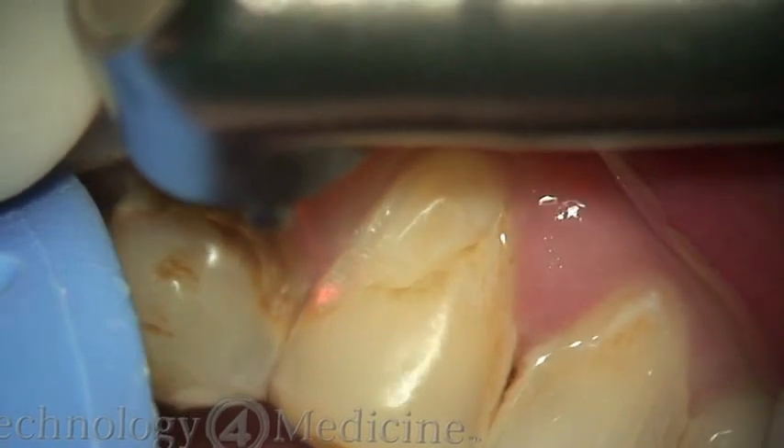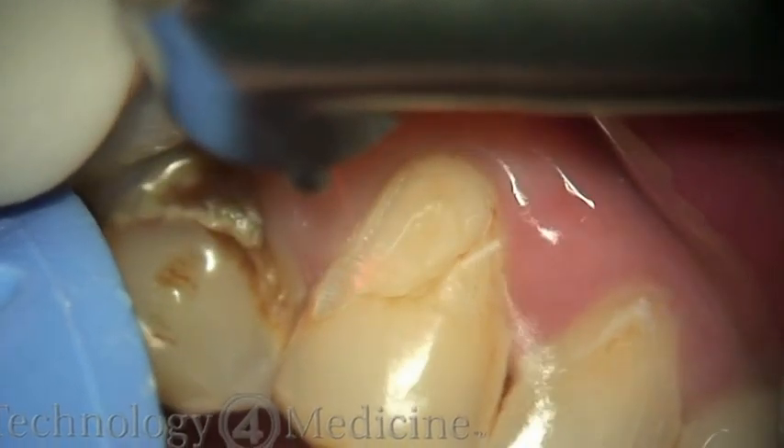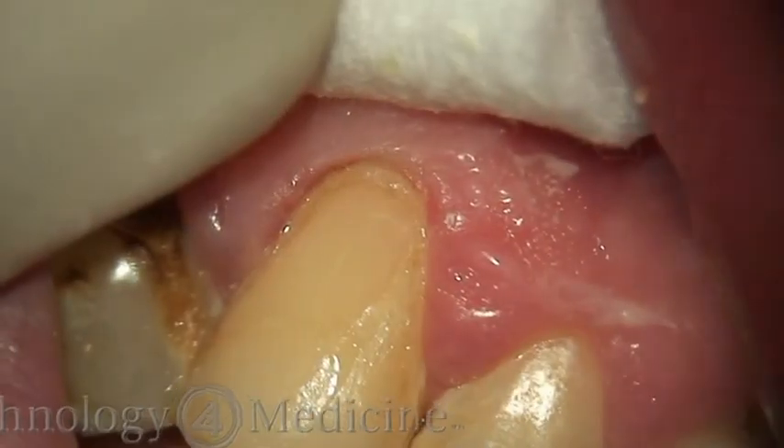These procedures, in actual time, take maybe 5 to 10 minutes per tooth at most. It's very simple and easy, and the patient loves the fact that they're not numb and can go out and have lunch right after you're done with the filling.